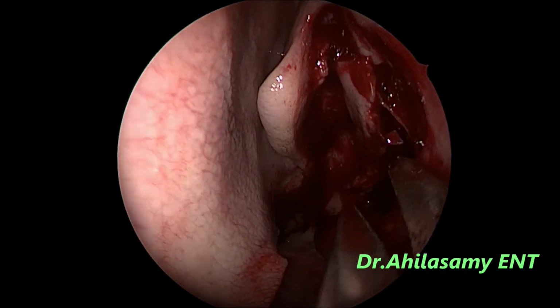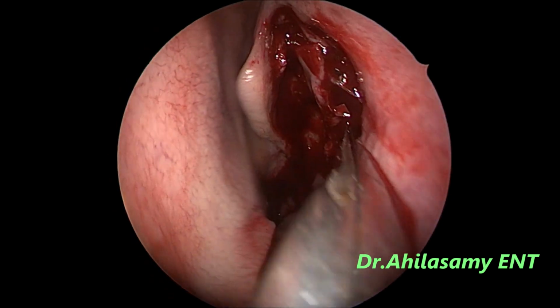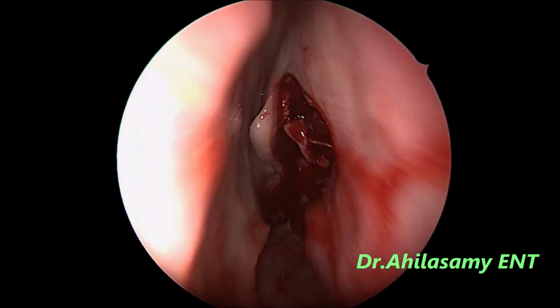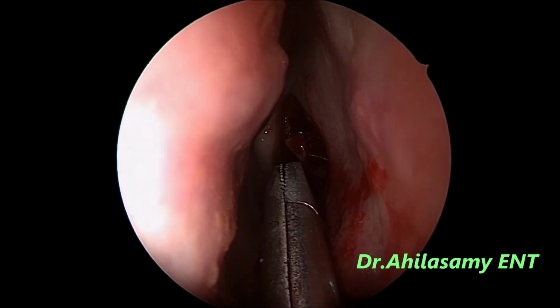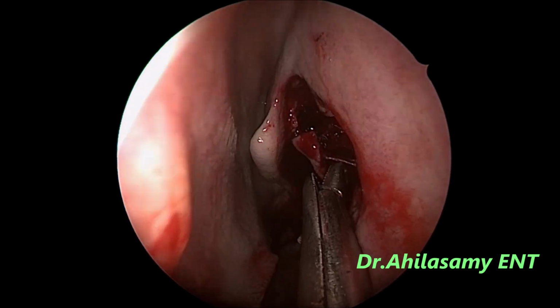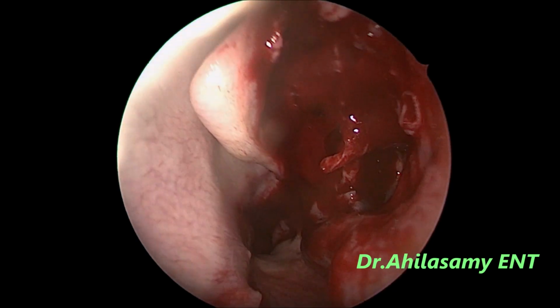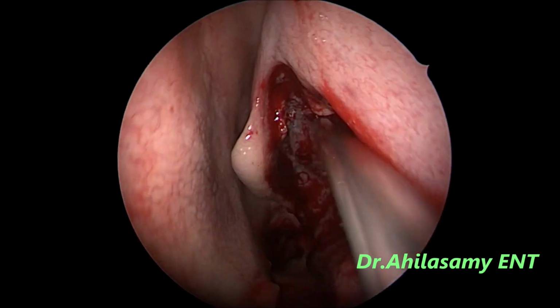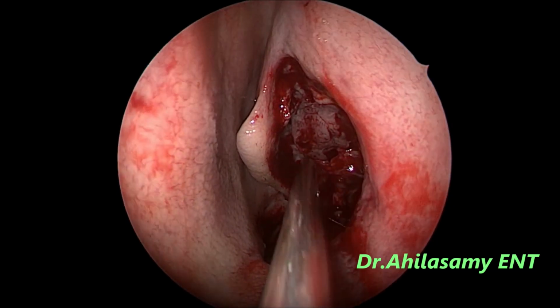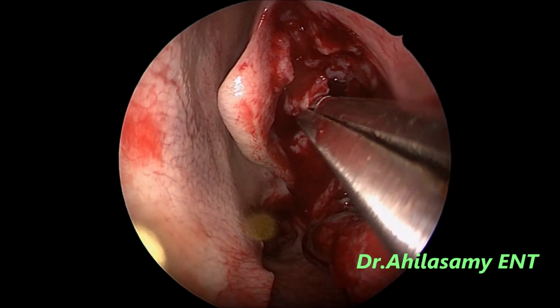Now I am using scissors to cut the superior and lower end of the uncinate rather than pulling it blindly, shearing the mucosa. The uncinate has come out in toto beautifully. That's a view of the bulla and the maxillary sinus. See, the BP is around 156. We don't give hypotensive anesthesia, and the pulse was around 70.